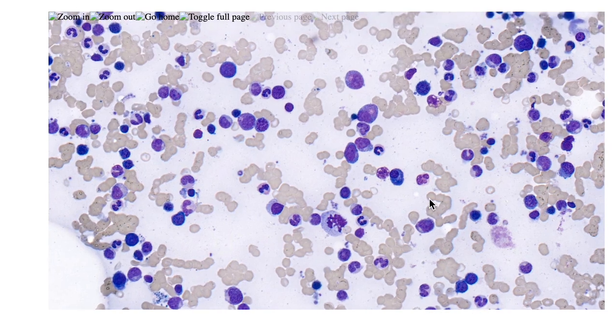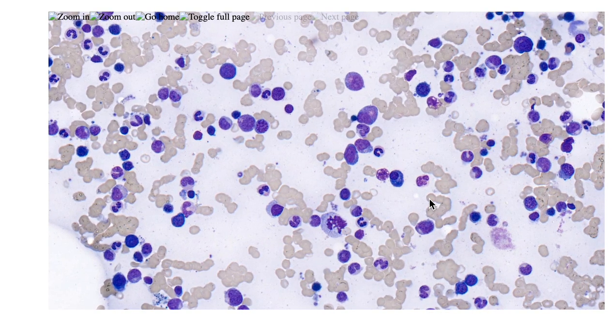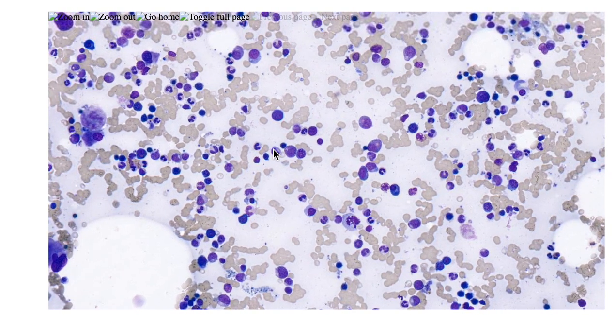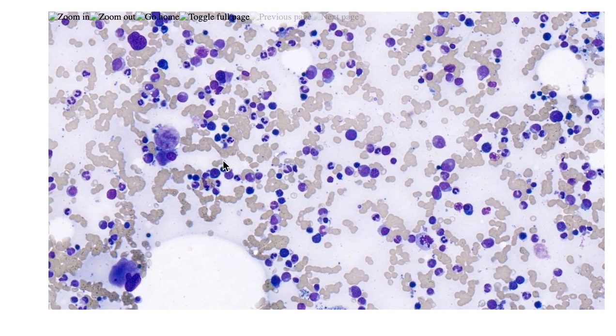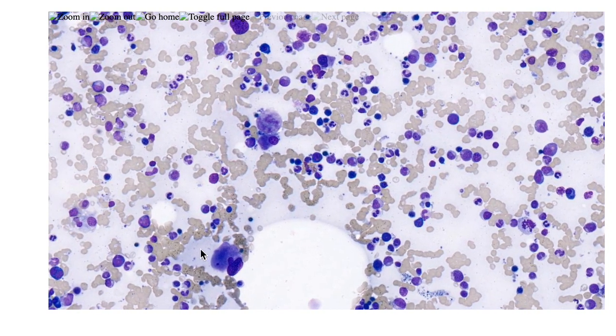I can have erythroid hypoplasia in this condition. This is one of the characteristic findings of the disease we're going to discuss. There is one more characteristic finding of the disease, which is these cells — what are these cells?